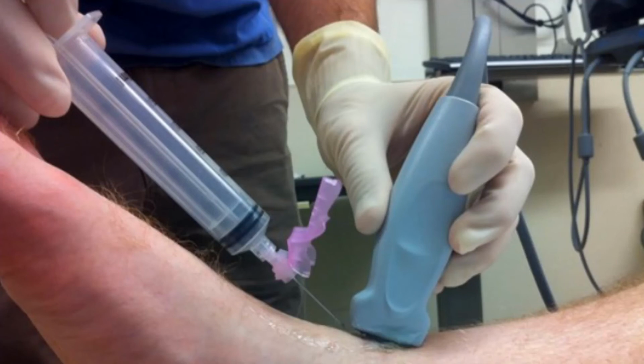You can also do this ultrasound guided, but please, if you do it, use a sterile probe cover. Essentially what you can do is put the ultrasound in the long axis view and use the inline technique. So you actually have your needle going in at the same direction or parallel to your ultrasound probe itself, so you can watch and visualize your needle going in the entire time.